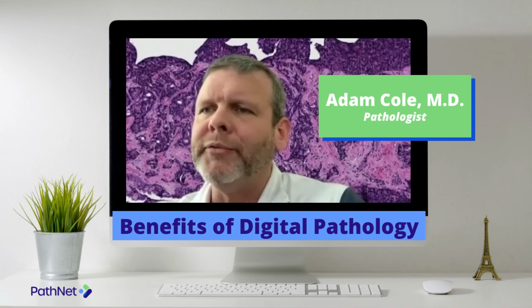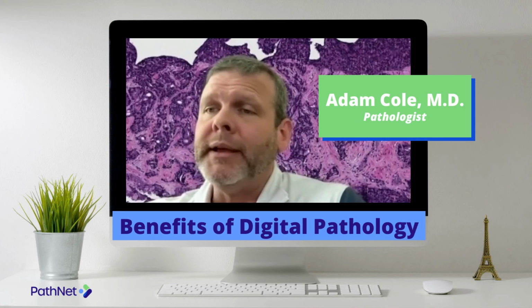But we're able to go to 40x, and like I said, again, the tissue clarity and the image quality is such that it's a non-issue.